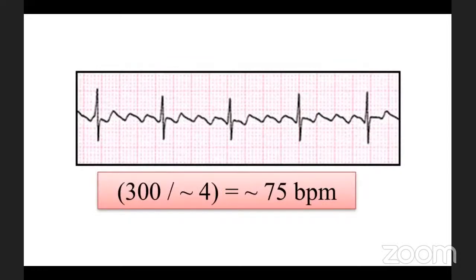أوكي طيب الحين هذه كيف نحسبها؟ نقول نعد كم في box between ال two R waves. هنا مثلا مو واضحة مرة ال R في أي box. فإيش أسوي؟ أسهل على نفسي أخذ أوضح ثنتين هنا وهنا. طيب بعد كم في box؟ 1 2 3 4. فإيش أسوي؟ أقسم 300 over 4، كم راح يطلع لي؟ 75. حلو طيب next slide.